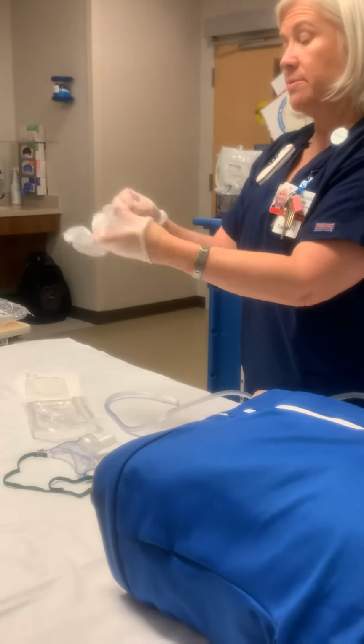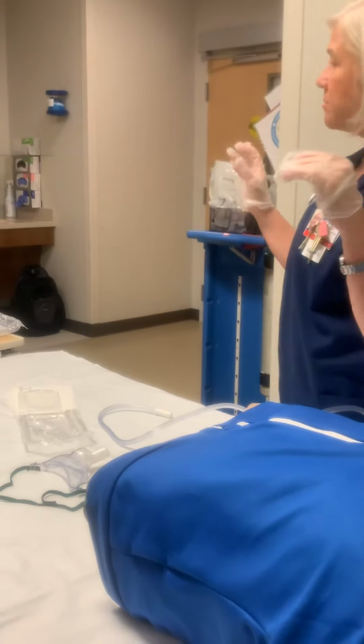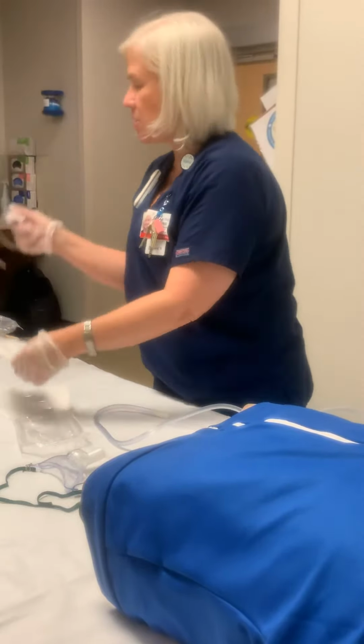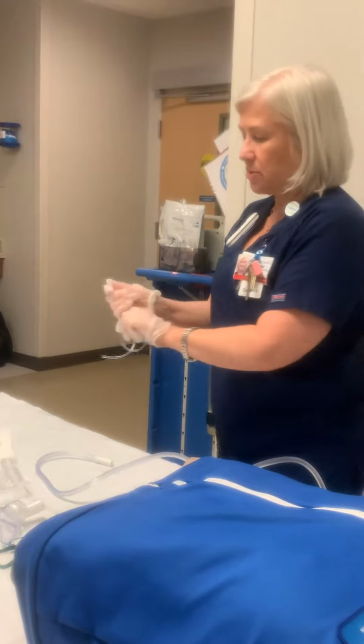And you can suction them as often as you want. There isn't any policy that reads that you can only suction them so X number of times. You can suction them anytime you want. So you have your suction catheter. It doesn't need to be lubricated. Do not lubricate it. I've seen people do that before.